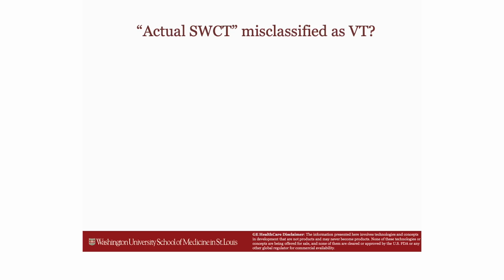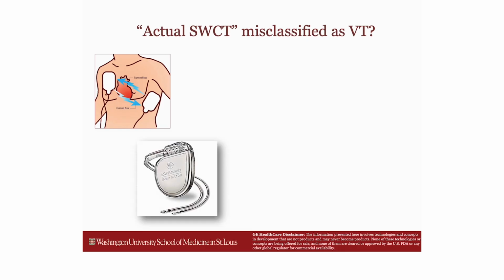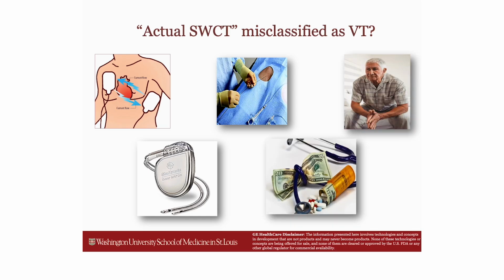Now, what about an actual SWCT misclassified as a VT? Well, it's not as bad. However, it can lead to wrong, aggressive, and expensive treatments, including inappropriate shocks, inappropriate ICD implantations, invasive procedures, increased healthcare costs, and also increased psychological stress on our patients.